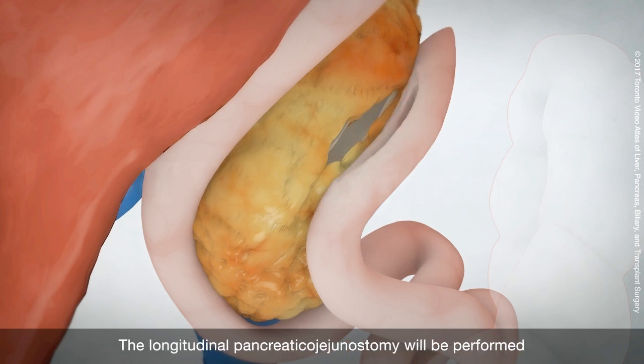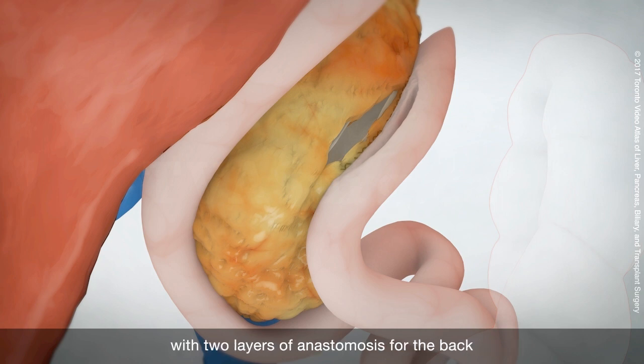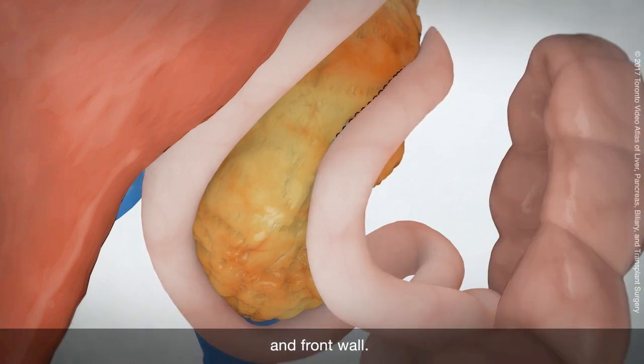The longitudinal pancreatic jejunostomy will be performed with two layers of anastomosis for the back and front wall.